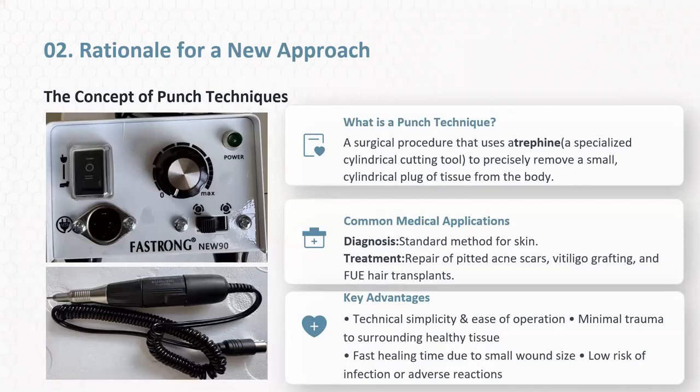Our new approach is based on the punch technique, which is commonly used for biopsy and treating conditions like acne scars. Its advantages are its simplicity, minimal trauma to surrounding tissues, and fast healing.